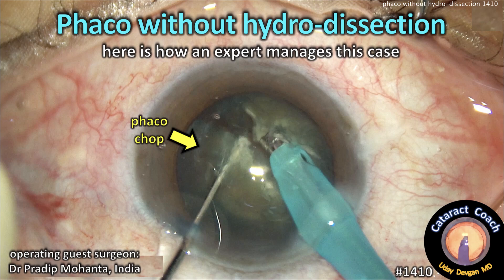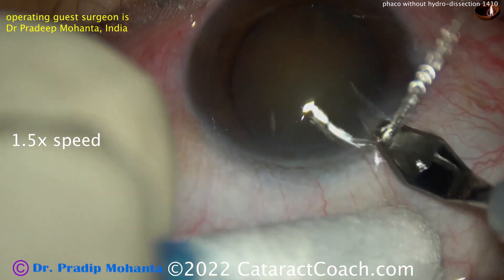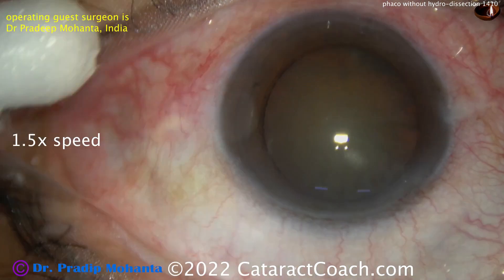CataractCoach.com — FACO without hydrodissection. Here's how an expert manages this case. Shown here is Dr. Pradeep Mohant from India, and the question is: why do a case without hydrodissection?